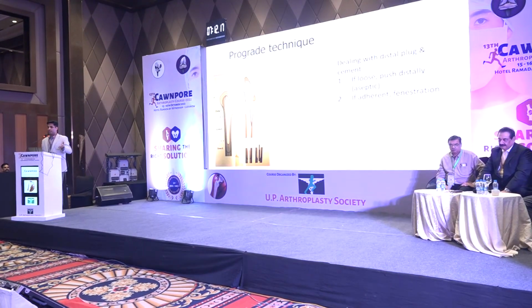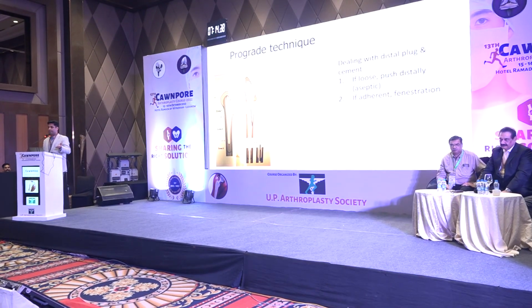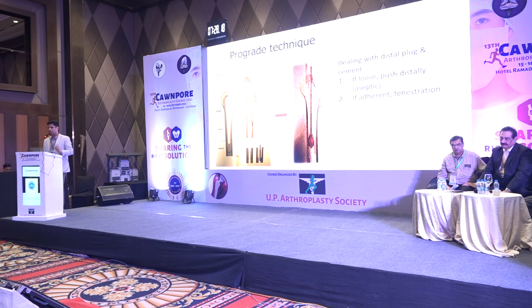So cement extraction can be done through the prograde technique, and then once you go down to the distal plug and the cement, you can either push it distally if it's aseptic, and if it is adherent or something, then you may have to make a small hole distal to the position of the cement and tap it backwards. Because otherwise what will happen is when you put in a reamer to put in your stem, you will go eccentrically and you may cause a perforation or you may cause a fracture. So be careful of that.